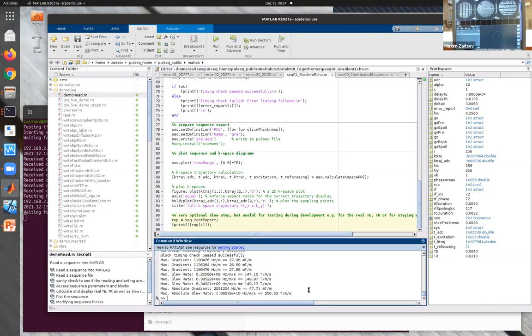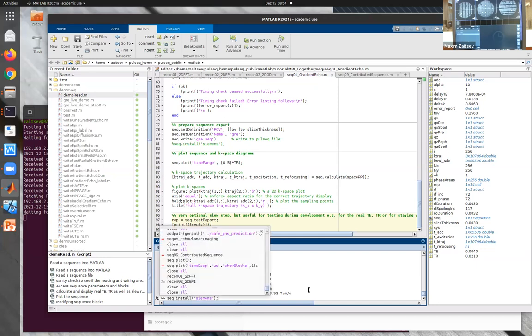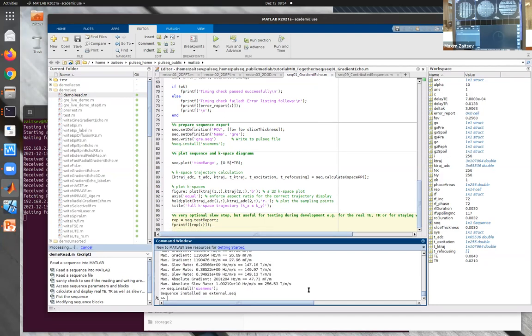So I would say we are at the point where we can actually install the sequence on the scanner. And in my connected network situation, I can do that. So the sequence install, it goes to the scanner.